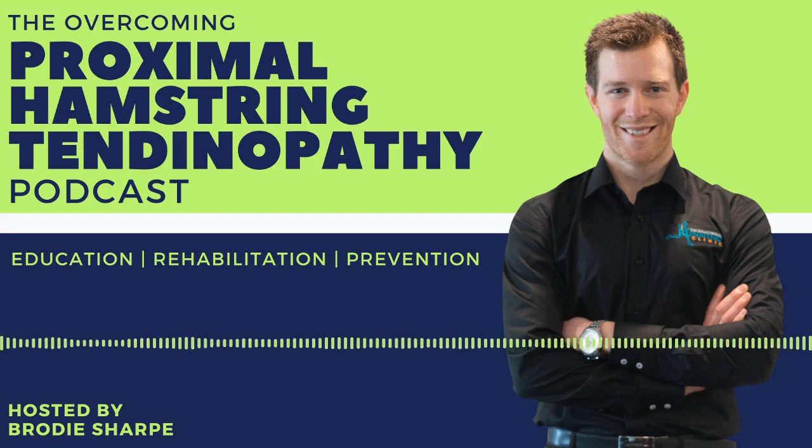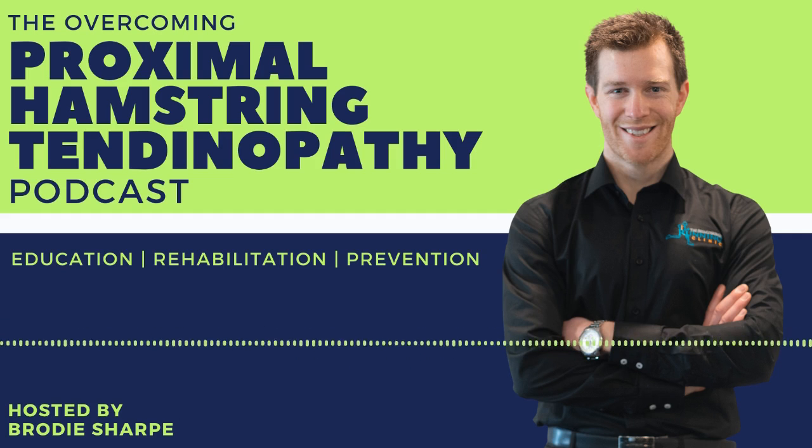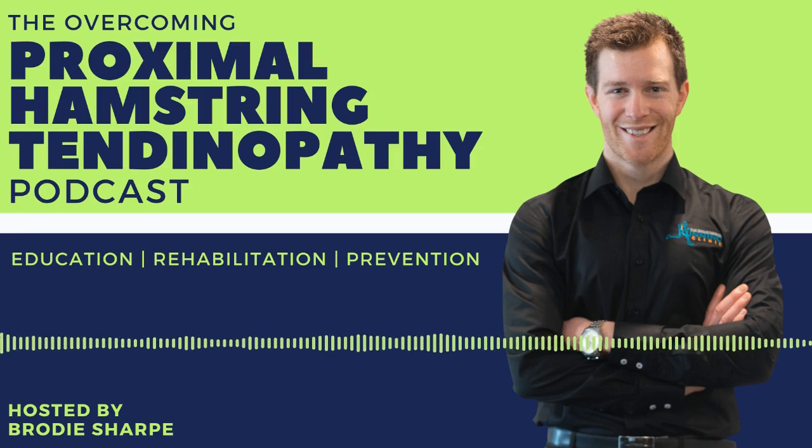So it's a very low risk modality, and as I said, it's used in medicine for kidneys, it's used in the heart, it's used even in very sensitive structures for erectile dysfunction, a different type called focused shockwave for men's health. So it's been used in very sensitive parts of the body, and you're not going to damage anything in the long term. I guess if you keep on giving people 30 sessions, you can end up causing more problems. But if you're sticking to the guidelines of between 3 to 5, you're very safe in giving Shockwave.